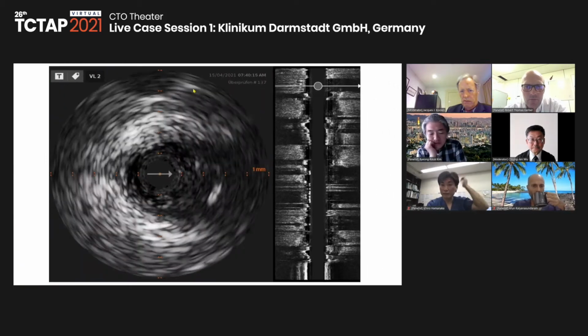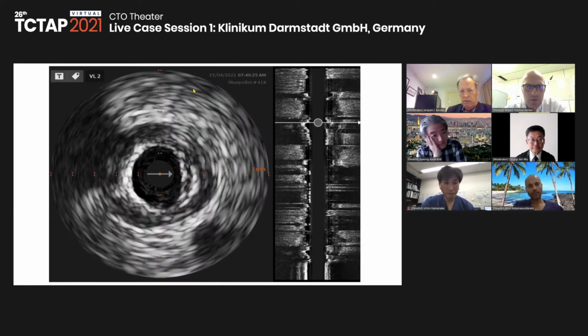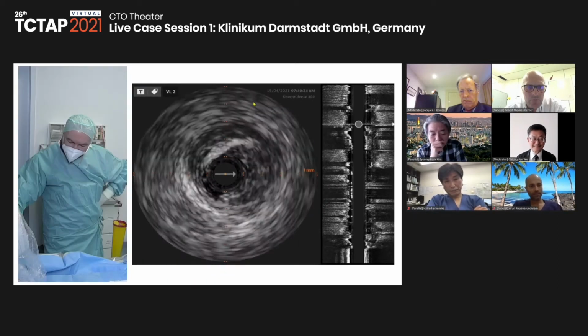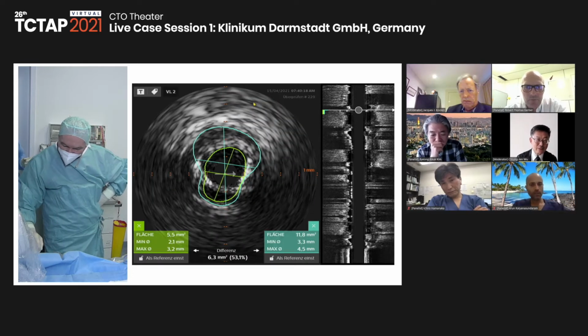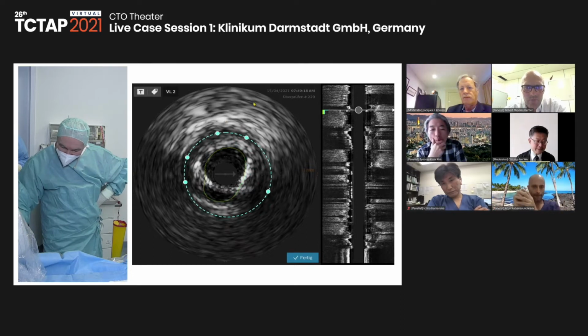It's rather soft here, and this is the proximal as well. This is the proximal RCA, concentric calcification, something for Shockwave or whatever. But very diffuse disease. The vessel size is still dilatable by what size of balloons, Gerald? I started with a 3.0. 3.0. Okay, great. A Sapphire.